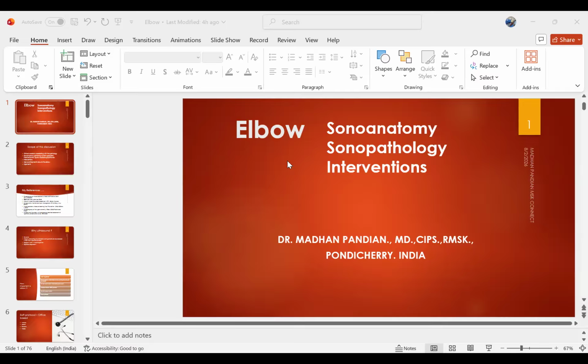True, sir. Sir, Preetham, we want to know the needle gauge for fenestration, the extent of fenestration and the volume of PRP. Volume of PRP, around 3 to 4 ml is good enough, sir. But fenestration you can do with a 22 or 23 gauge needle, be it a spinal needle or a 1.5 inch needle. Generally, I prefer to use the black 1.5 inch needle. So it gives good fenestration.